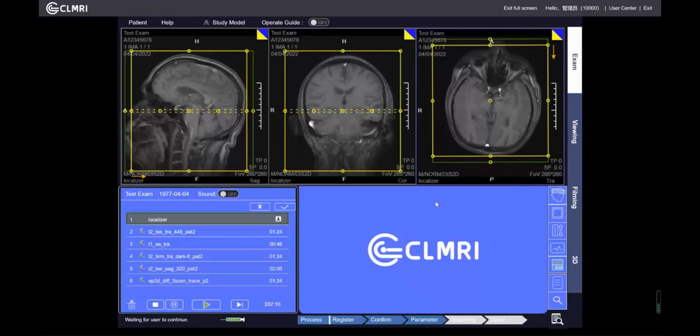Hi guys, I'm pleased to introduce you a kind of MRI simulator, which can make your laptop become an MRI console. So you would be able to operate just like an MRI scanner anytime and anywhere, only if you have internet.